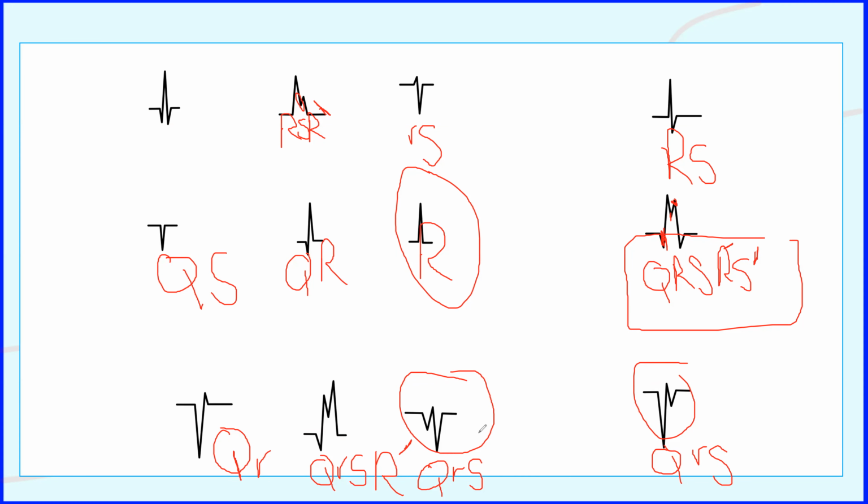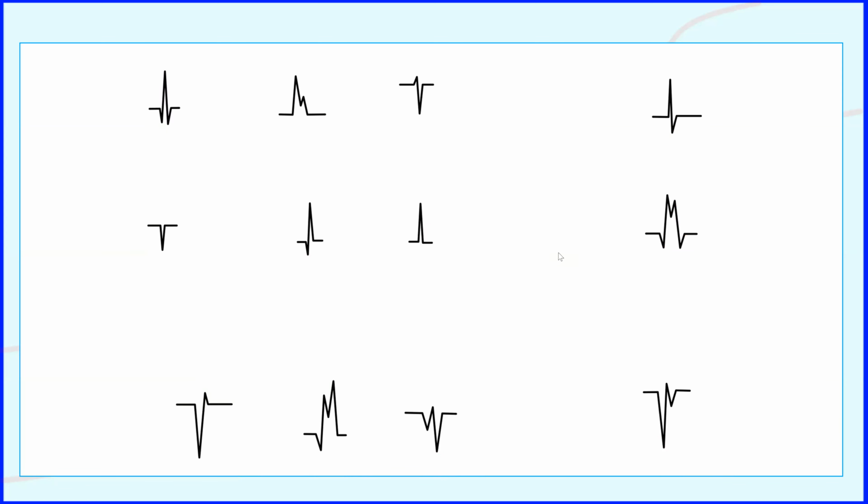They are the same with a small r wave. We usually don't use the small q, so you should not use it. We use only R capital or R small, and that's it. Although some reference textbooks say we can use a small q for the small Q waves, it could be very complicated and will be confusing.